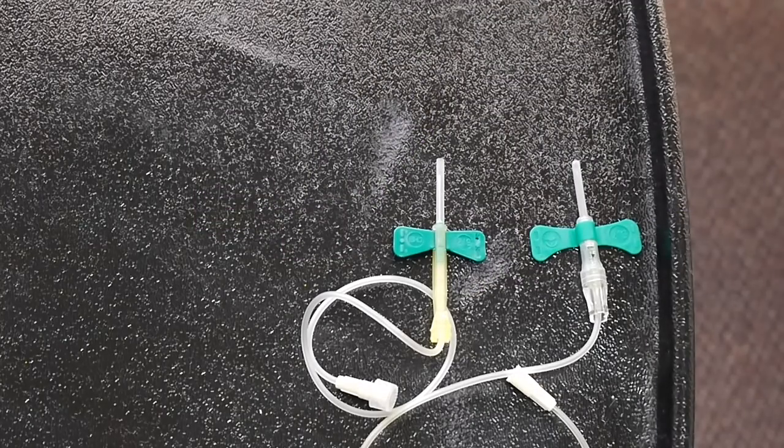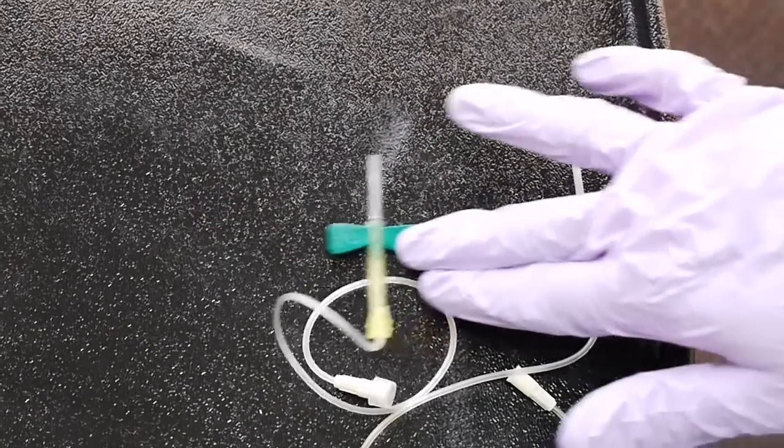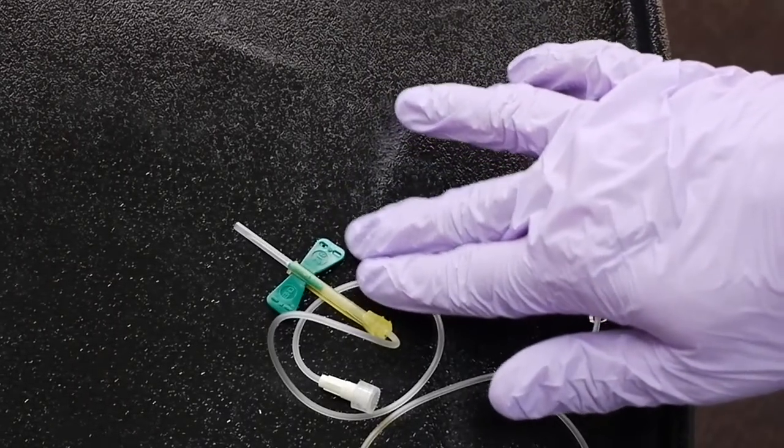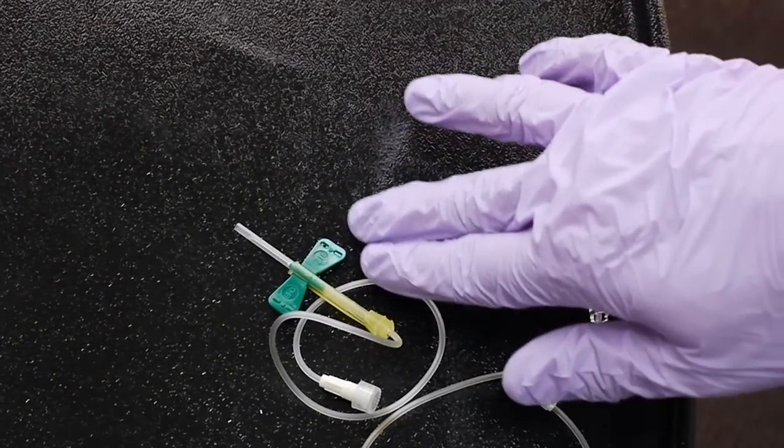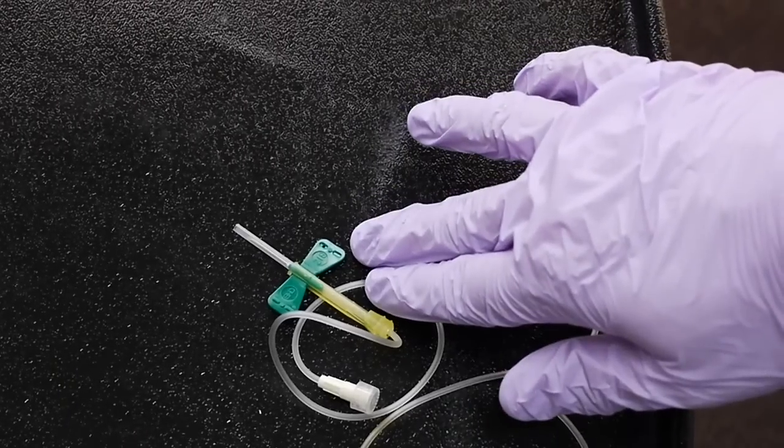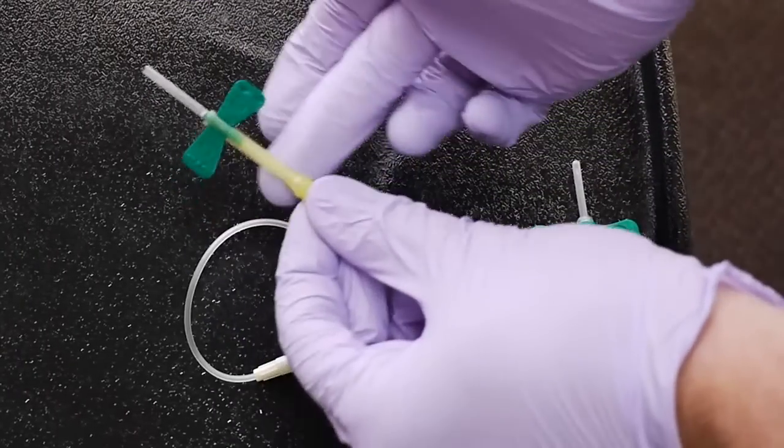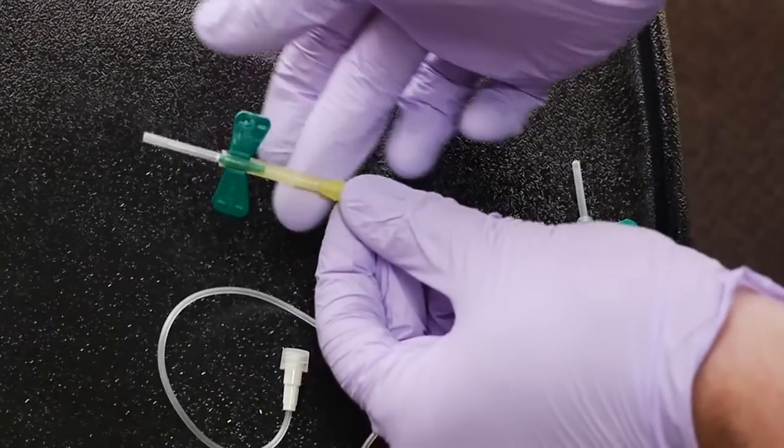Next device we're going to use is the butterfly. Now remember, the butterfly is the number one device that is a cause of a dirty needle stick. So this one, the first one, has a kind of retractable needle.